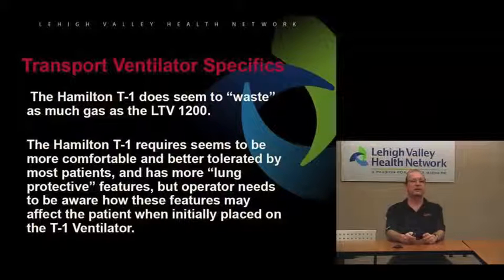But you as the operator need to be more aware how these functions may affect the patient when initially placed on the T1 ventilator. Now you're probably asking, how would I know that the T1 ventilator is more comfortable? Well, subjectively I see that the patients seem to tolerate it better. Objectively, as best I can, it's a practice I started back in the service when we had new ventilators or ventilators we weren't familiar with. I actually hooked up a piece of practice tubing, put the same exact settings in, maybe for volume ventilation, same inspiratory time, same alarm limits, same everything.